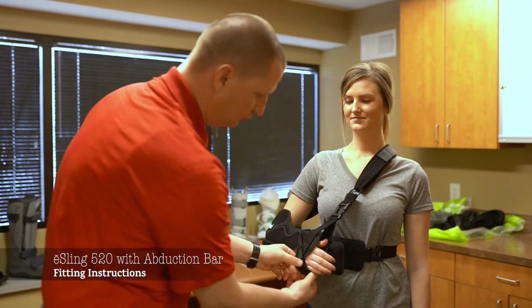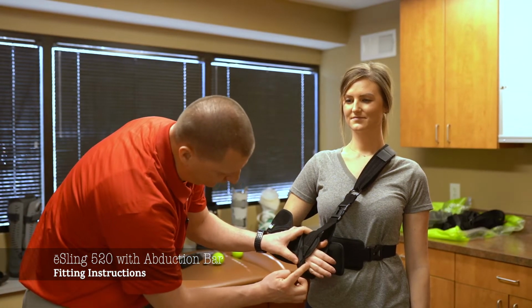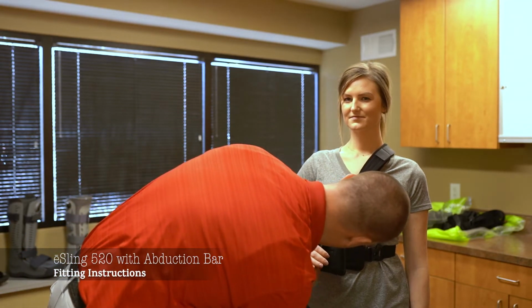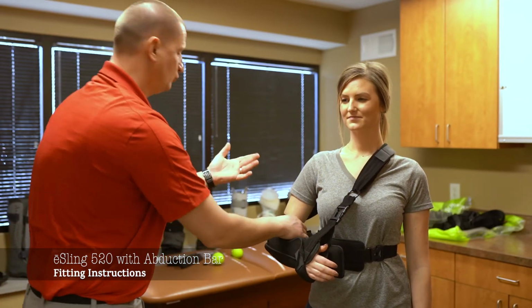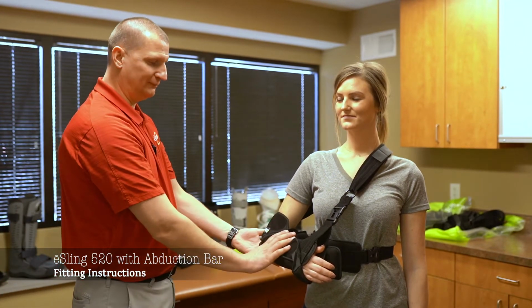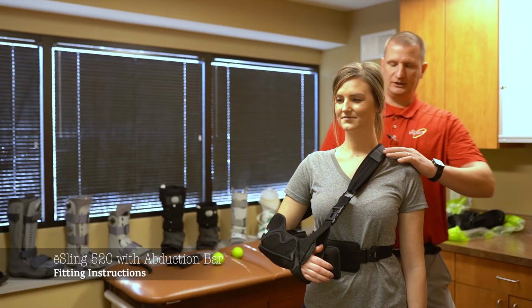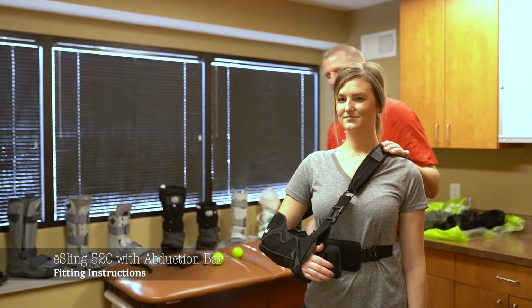Now again, we can get into folding back this portion of the cradle to get past her knuckles. Okay? And these are just going to Velcro back. Once this is complete, I also want to check with the patient, making sure that her arm is down into the cradle, it is not shrugging her arm up from pulling the cross straps, and that this shoulder strap is adjusted over top her shoulder, not too forward, not too back.